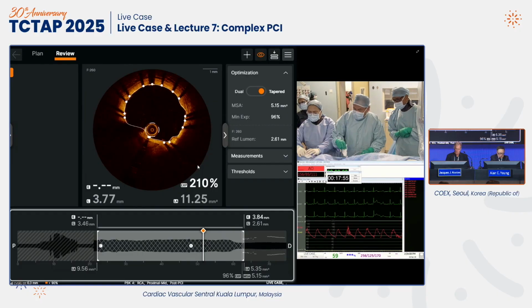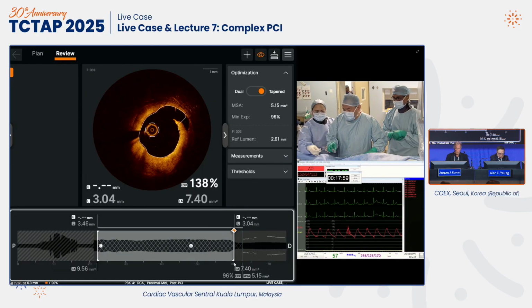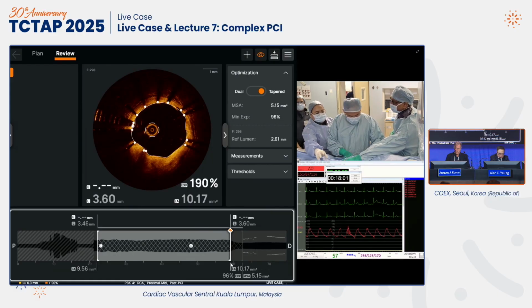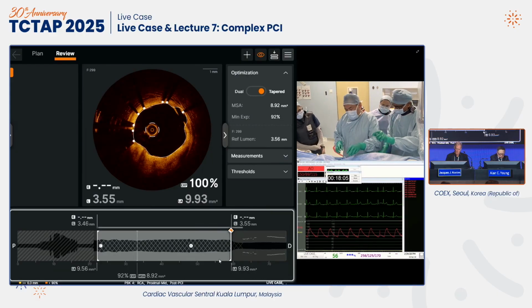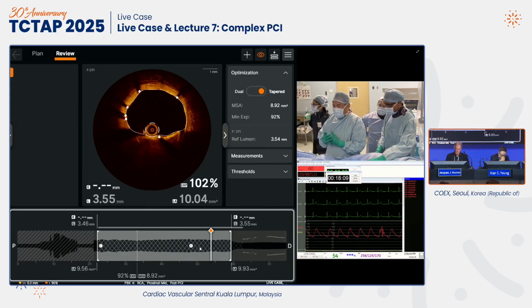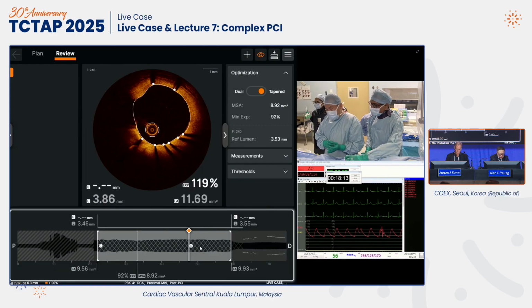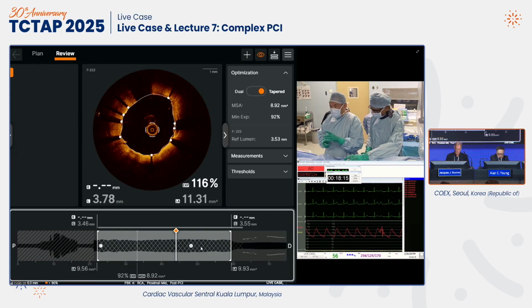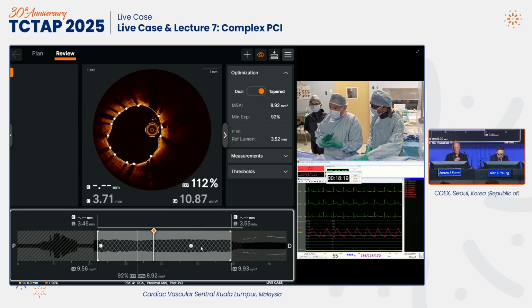I presume you just use it similar to an IVL balloon, because obviously this is not a primary balloon to cross an uncrossable lesion, right? Because the profile is not going to be that small. So you would still need rotational atherectomy to open up and cross such lesions. Not really, Alan, because as you saw just now, we managed to cross, and quite often you can actually do it by itself, most times.